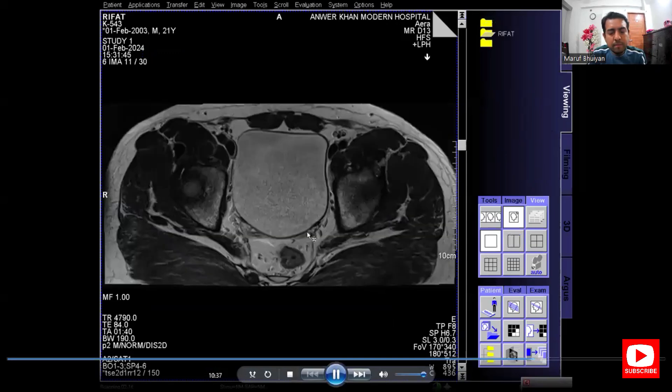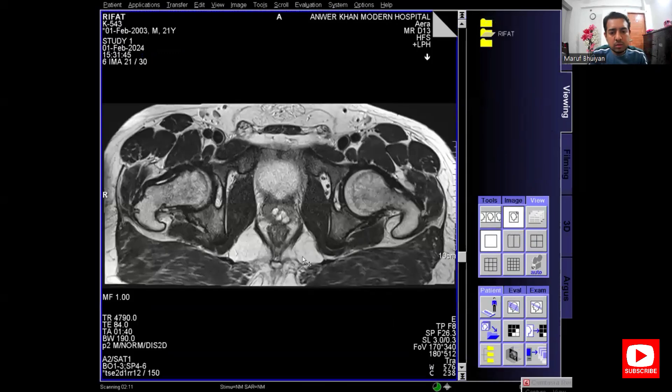Now I am in the viewing. This is the T2 axial hip joint image.